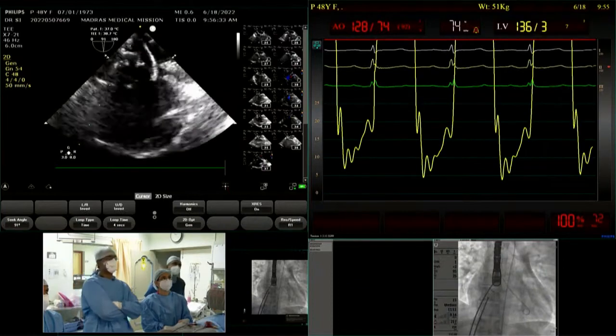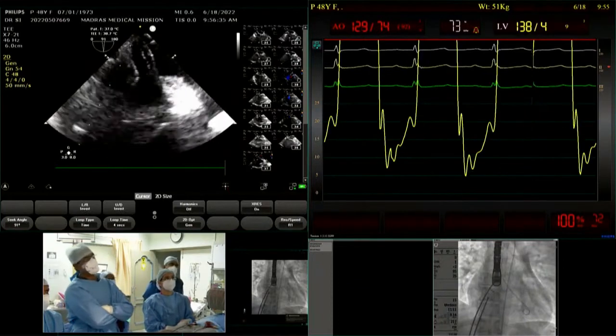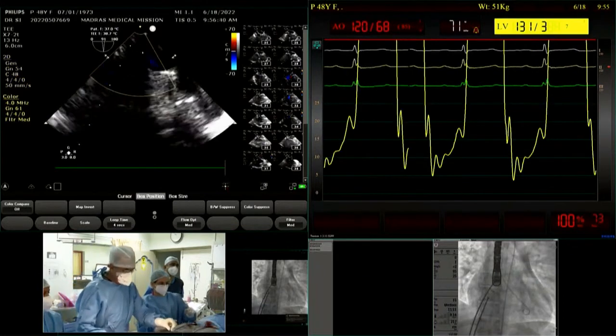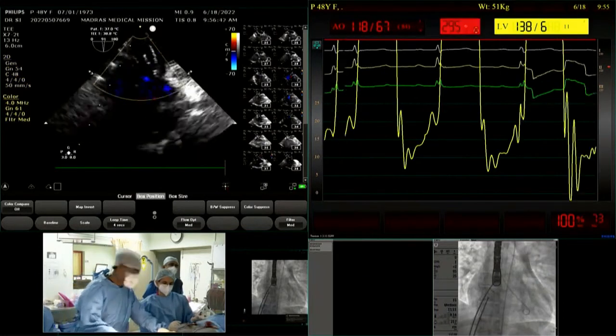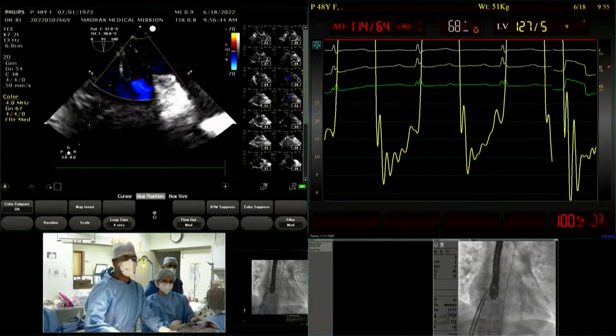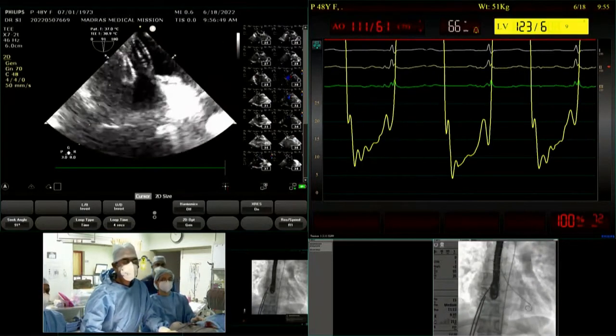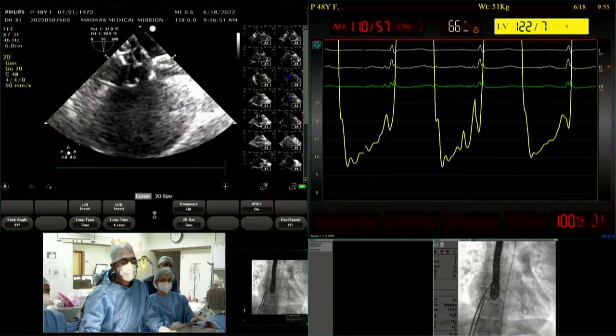Now he is focusing on the inferior defect completely. Color now the inferior defect. Okay, the moment I release the cable, then probably it will fall in place. The case, he's saying, is very sick, so we'll have to move to Dr. Varakkan, so you can release fast so that we can move.